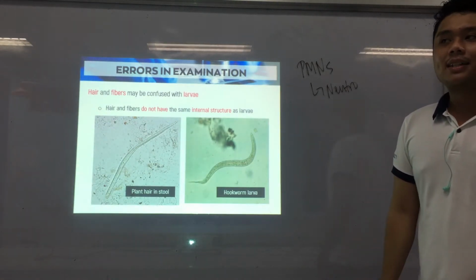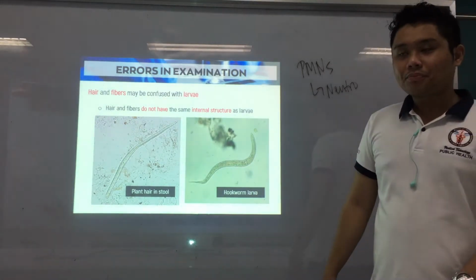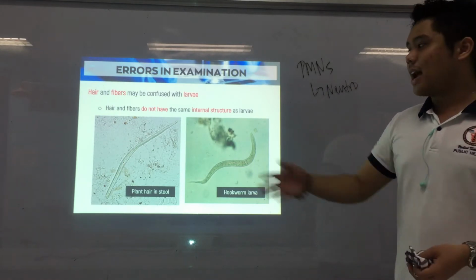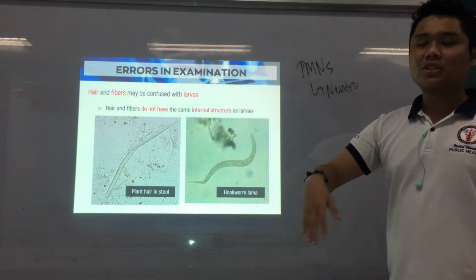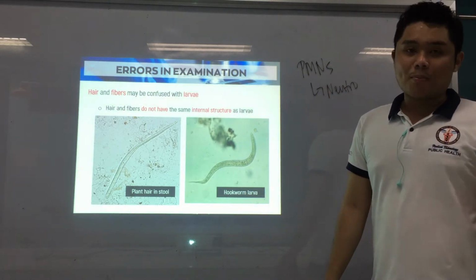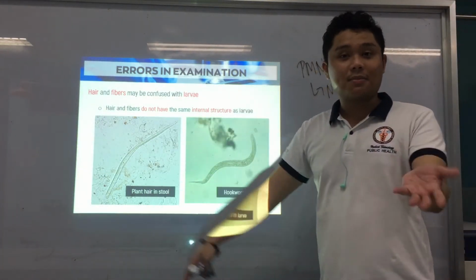So there could be spring, autumn, that could introduce pollens or plant fibers that have been airborne because of the season, and then it lands on our stool sample. All right? But yeah, or also from the food that you eat.